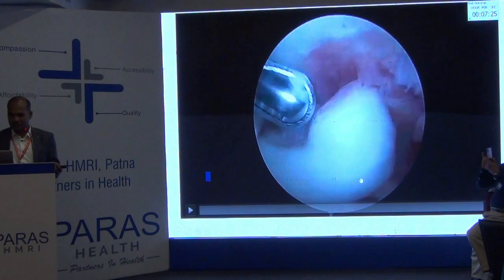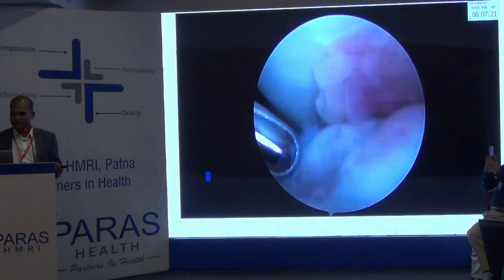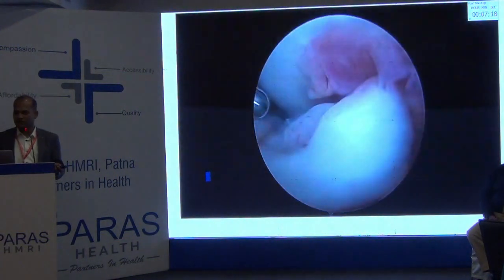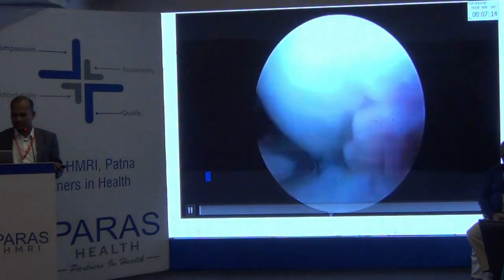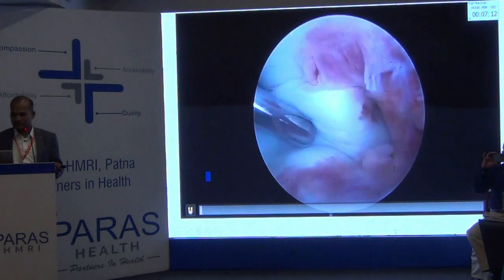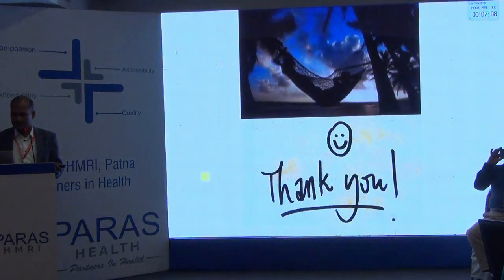So this was the intro picture. This patient was having an ACL tear also. You can see there is one tear there also.